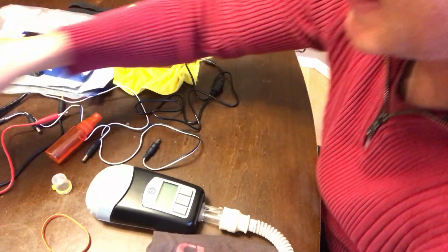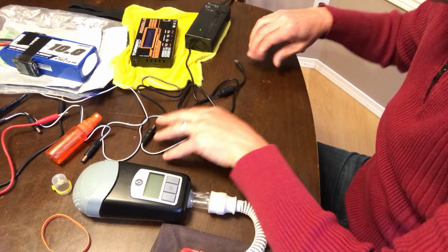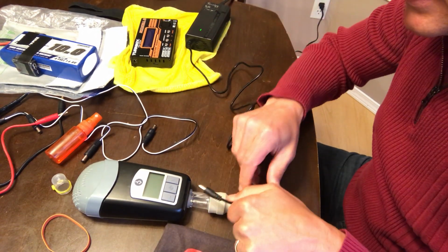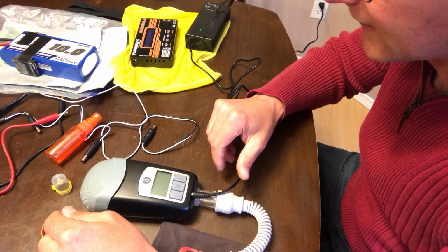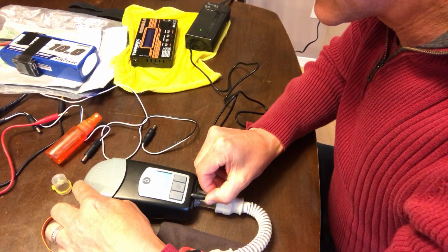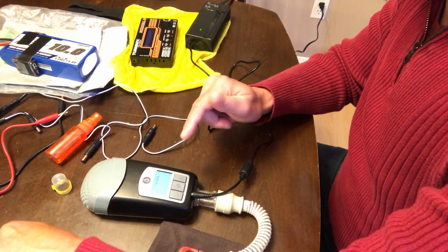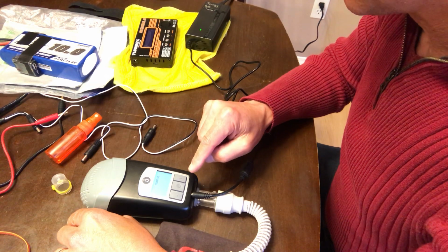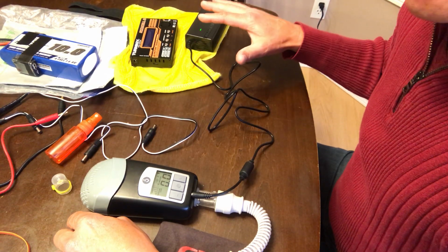The only thing remaining here is the power to this device. Now from a wall, you can just simply plug in your device and it'll power right up. It always takes a second to get the juice flowing. It must have some internal protection circuitry, which is great. So once that thing turns on, it's ready to go. Now, that's if you're at a wall.